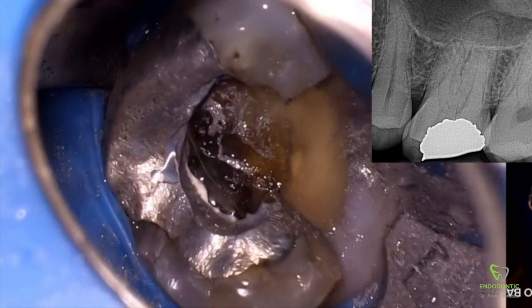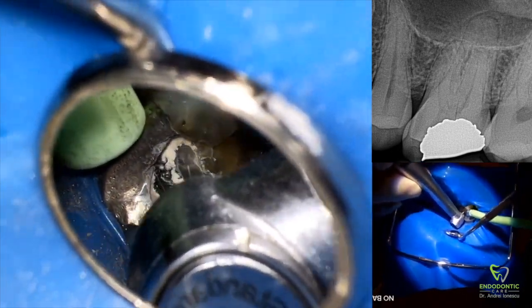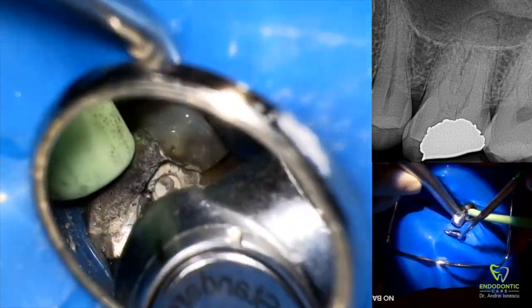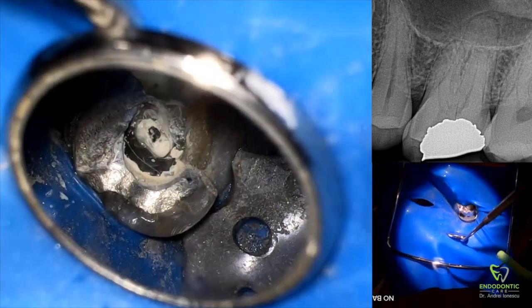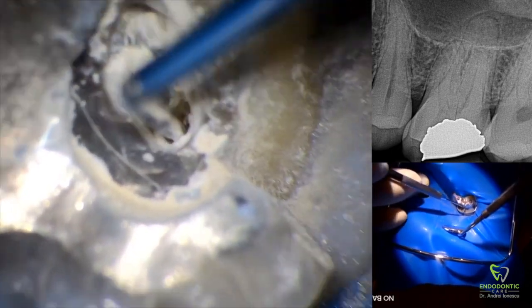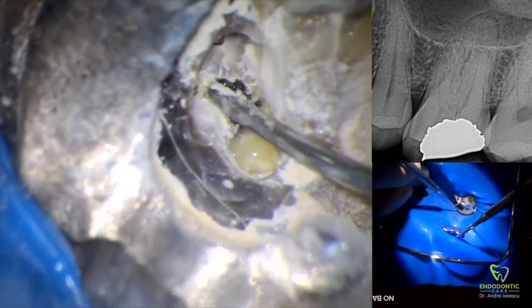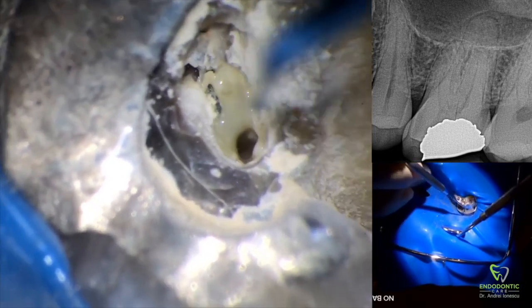We're also going to take note of the color of the dentin at this level. The dentin is brown, probably because of the amalgam leaching in and staining the tooth. We're going to see how this changes as we start to remove tooth structure. You can now start to see the access taking shape — we break into the palatal pulp horn and see a little bit of pus, but we can tell the rest of the pulp chamber still needs to be uncovered.